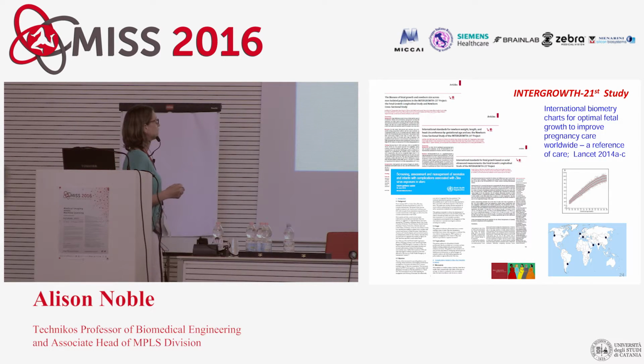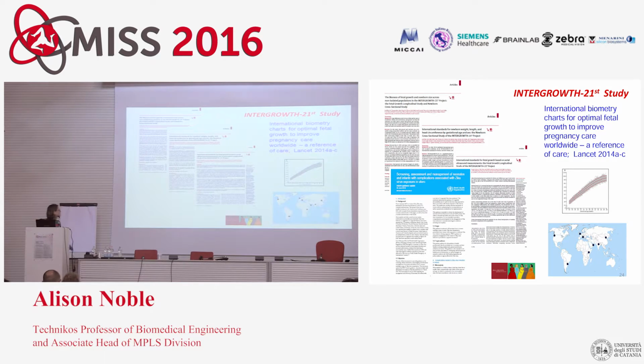My work has very much been motivated by my association, as a member of the steering committee, with an Oxford-led project called Intergrowth 21st. It was a large Bill and Melinda Gates Foundation project. Its obstetrics goals were very simple: to come up with fetal growth charts. Now, they exist today, but they are for populations, and by being population-based, they're often derived from local communities, and can also be a mixture of healthy pregnancies and ones that are not healthy.